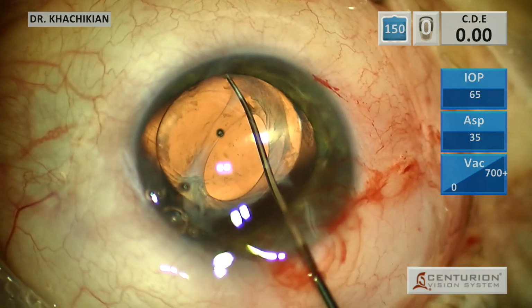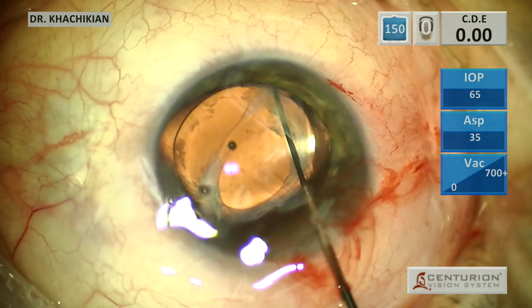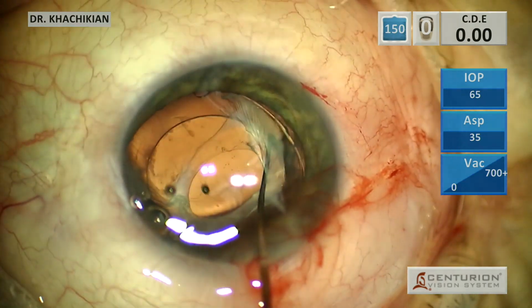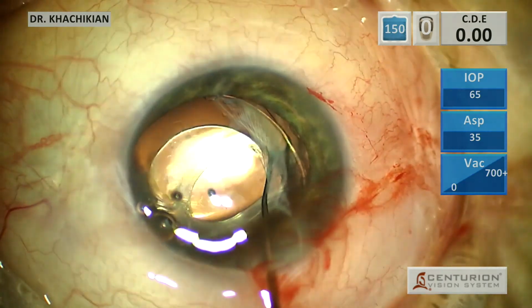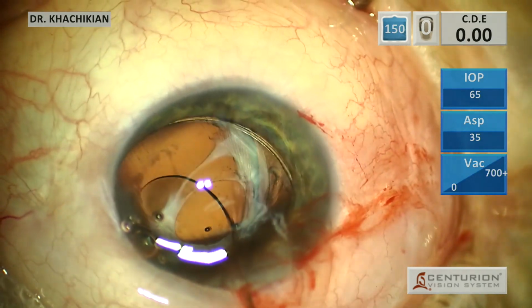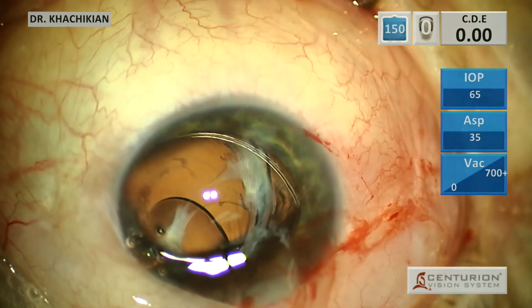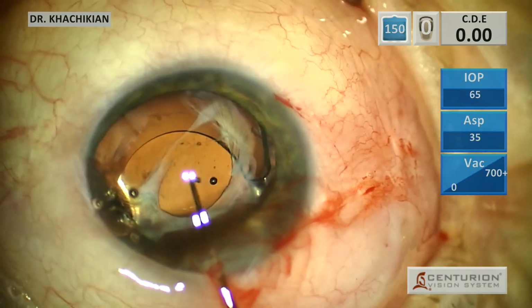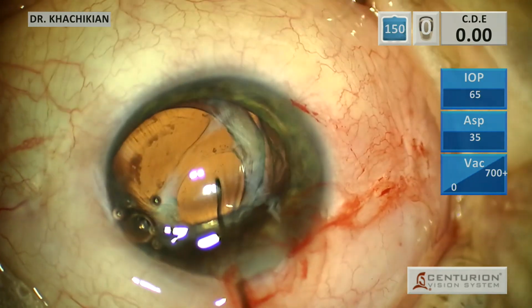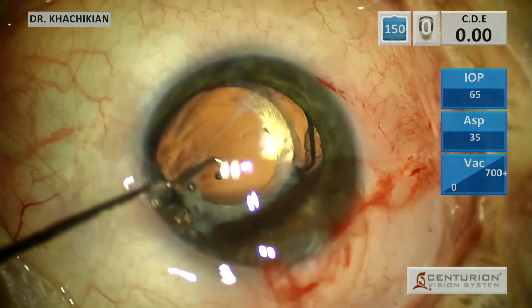You can see there that it's over. So we will manipulate it to try and get it on the opposite side of that capsular tension ring so it's not overlapped. And that will allow, there we go, that capsular tension ring to expand. Be careful of those zonules, you're pulling on them. That will allow the capsular tension ring to expand and keep the phimosis from occurring. And we'll rotate and get this haptic where it needs to be.